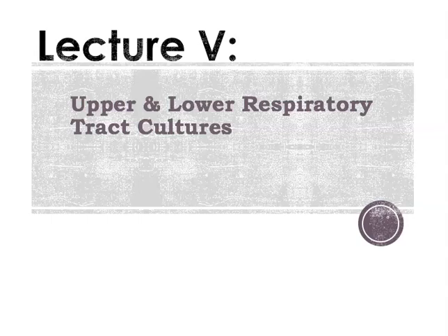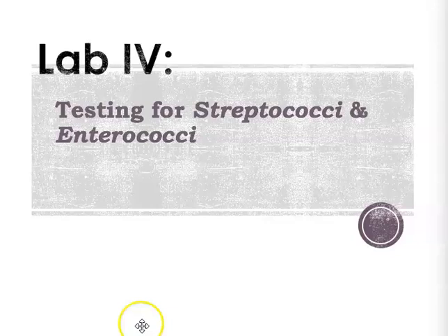which is indicative of group B strep, or negative is no color change.